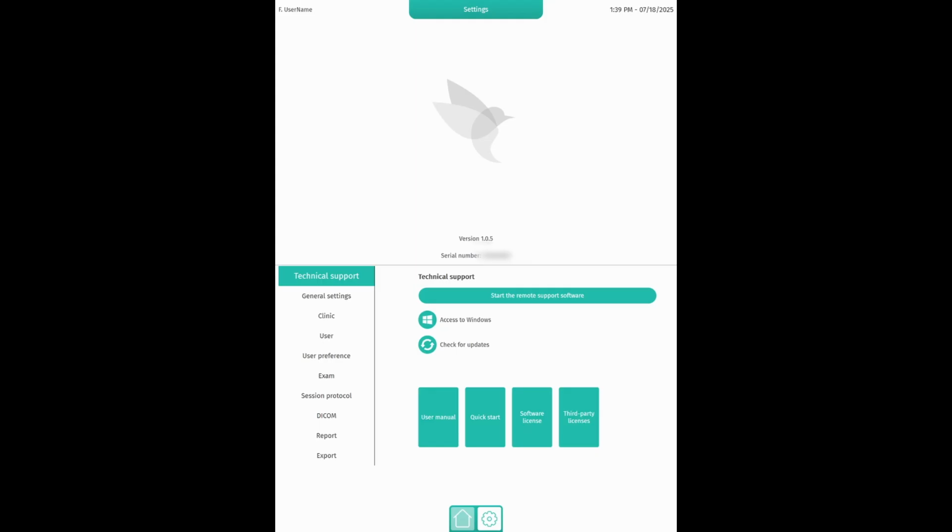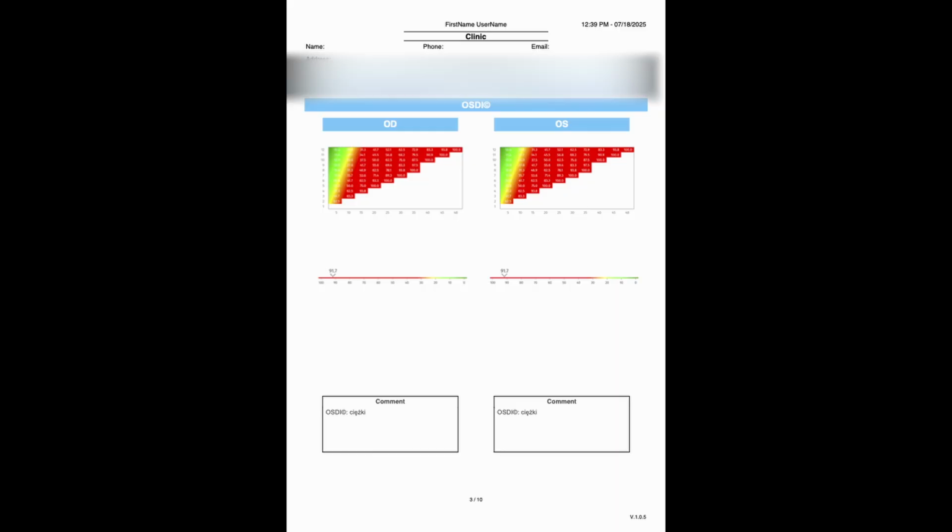So possibly in future updates, we are going to see more indices, and it's going to be more comprehensive. Okay, that was the presentation. Right now it's time for a review. You see that this machine is not really complicated. It's easy to use. It's not like Corvis, my previous review, and it's a very good sign, because the next question I want to always answer is, who is this machine for?